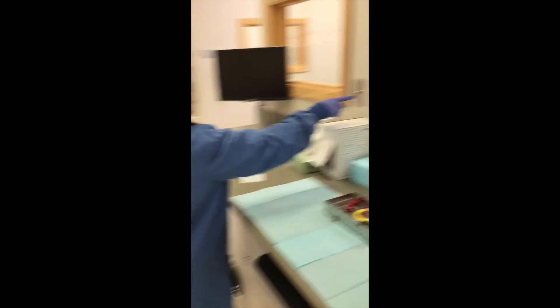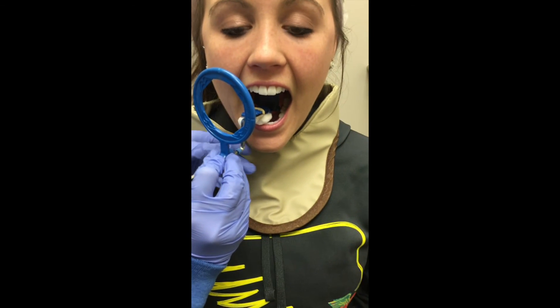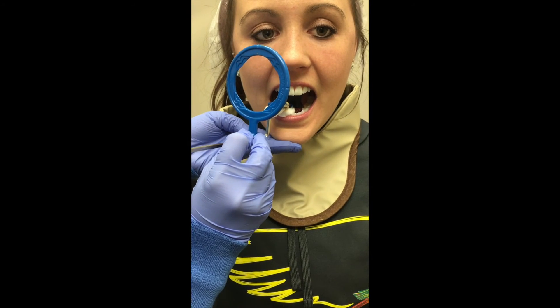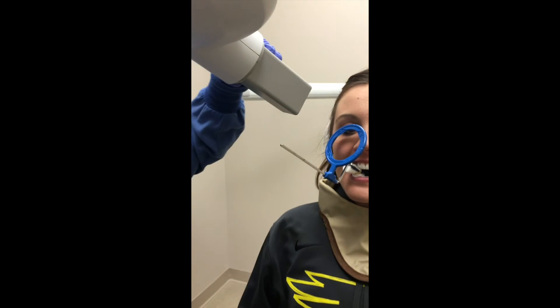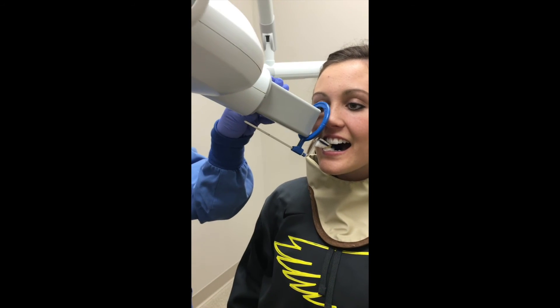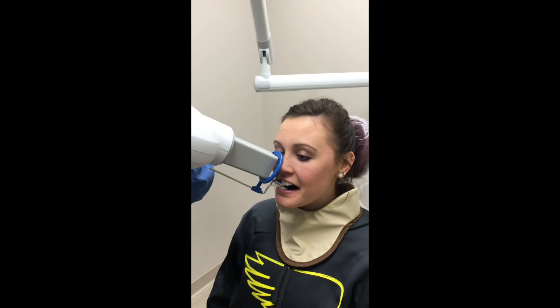Press the button to expose. Position the receptor parallel to the long axis of the right maxillary canine. Have the patient slowly close on the bite block, then move the aiming ring towards the skin surface. Center the positioning indicating device so that it lines up with the blue circular target. Make sure your anterior rod and your rectangular collimator are positioned parallel to each other.